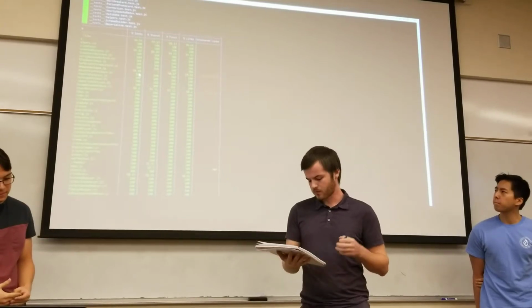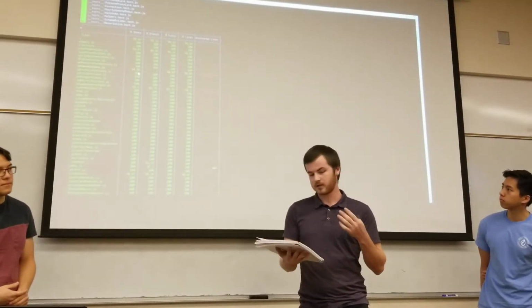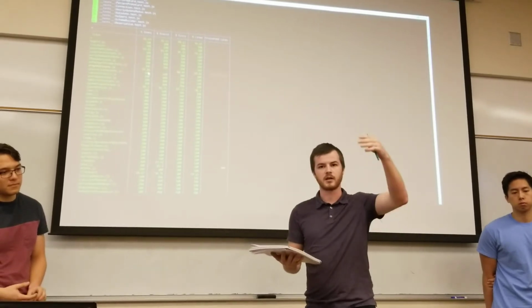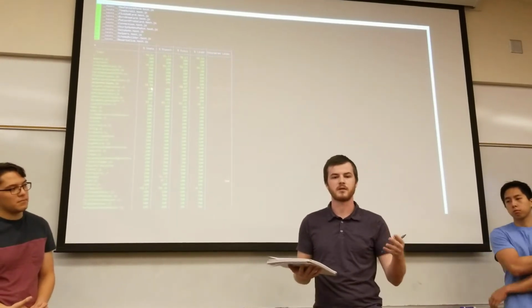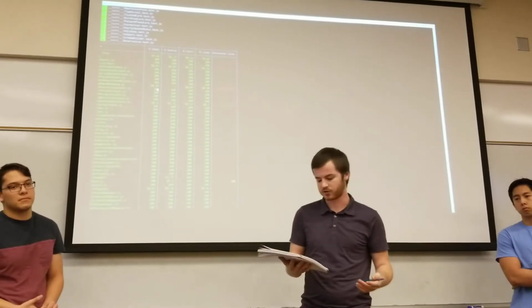Then a couple other small functionalities we still need to add. We need to give alert notifications when the graph area in the volume graph changes color. You know how it changed from green to yellow to orange to red? We want to supplement that with an additional alert to the screen so that the doctor definitely knows that has happened, because it has to do with the safety of the patient.